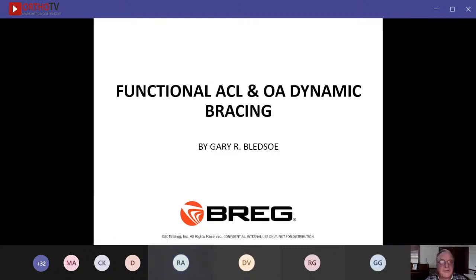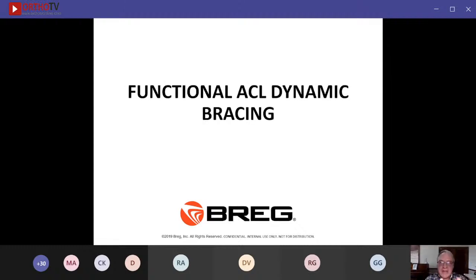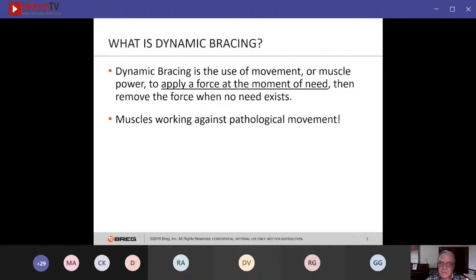So first I would like to say namaste and talk a little bit about functional OA and ACL bracing in the dynamic sense to get you to understand what this means. Functional ACL dynamic bracing is a little bit different, and we're going to address ACL before we do OA. But dynamic bracing is basically the use of movement or muscle power to apply a force at the moment of need, and then remove that force when no need exists. So this is basically muscles working against the pathological movement. So in the case of an ACL, we need to prevent subluxation anteriorly. So we apply increased force as we move into extension, and then when the leg moves back into flexion, we take it away.